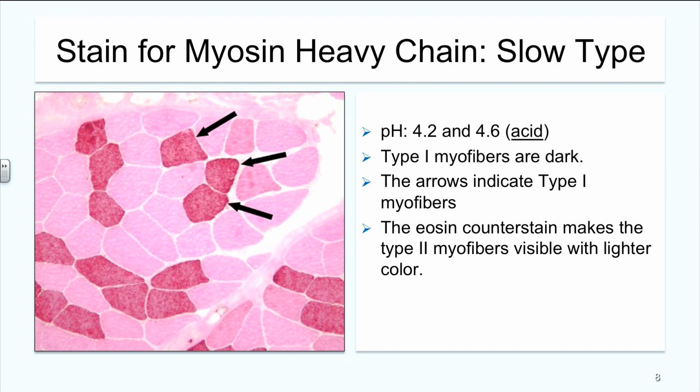People can use in their laboratory different counterstains and different colorimetric reagents, so they can come up as black and white or brown and light, or again here like pink and purple, or dark and light. Anyway, that's the goal of this testing.